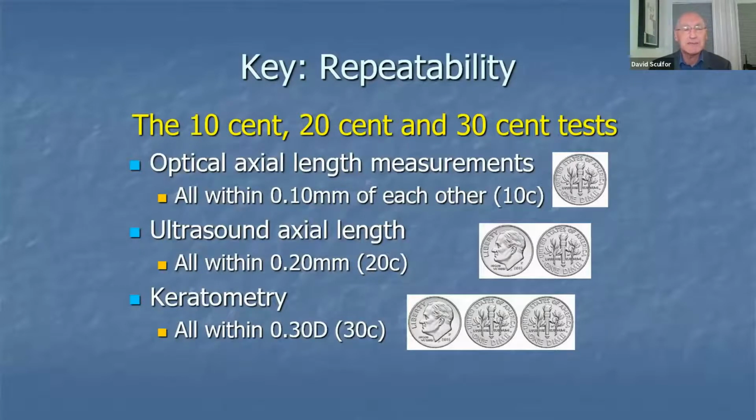That's actually very easy to achieve, but if the patient is moving around, sometimes you will find some outliers which you need to take out.